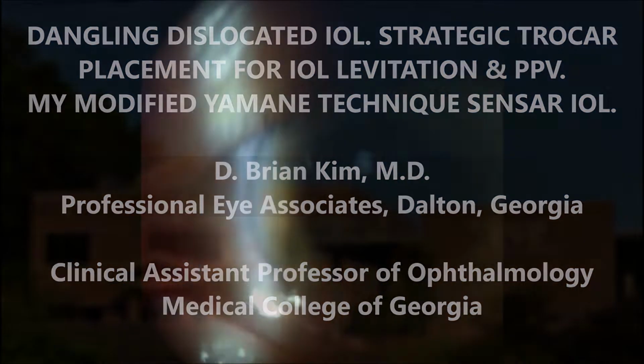As you can see, this is at the slit lamp. This is the left eye. And I'm having the patient look side to side and up and down. But you can see the lens is dislocated infranasally. But also the lens is sitting really far back. So it's not just at iris plane. It's sitting much more posterior in the anterior vitreous space. Interestingly, there's not much vitreous that I see in the anterior segment at all.